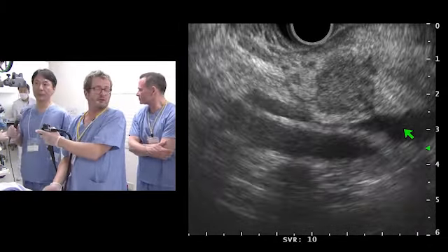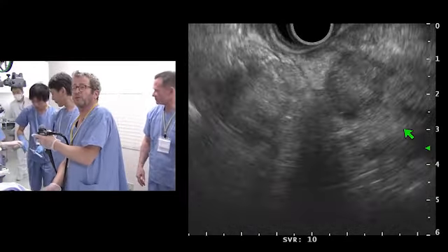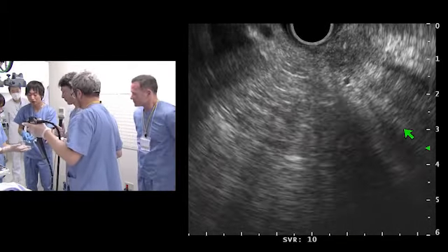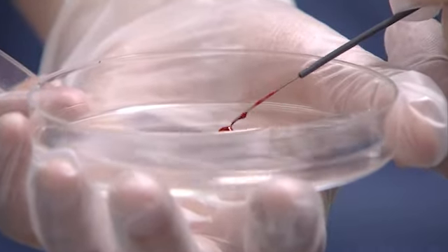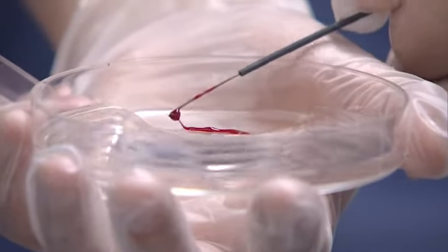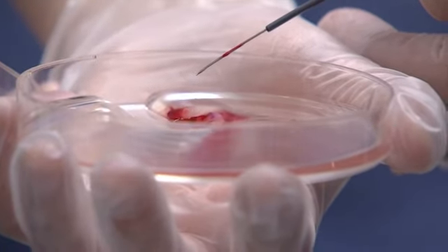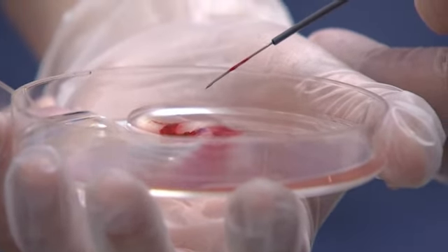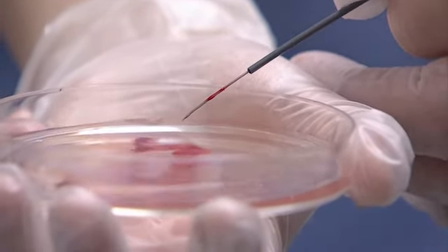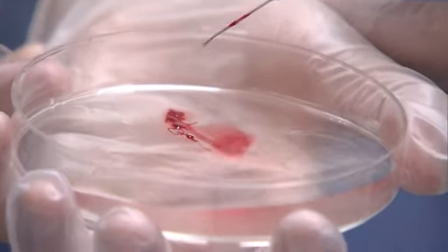But as soon as you insert the needle, it is nevertheless a little rigid, and then you are missing the position. So we want to show the specimen. Yes, please do it because this is the principle. Here we have blood only. And the core looks usually... no, we need to do it again, because I see only blood. Yes, push some air. We need to do it again.